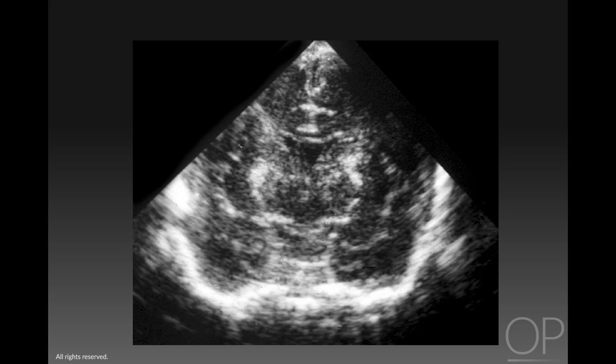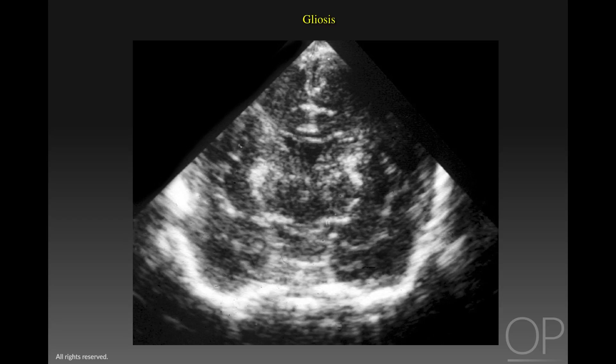Here is another infant who has brightly echogenic symmetric lesions in the basal ganglia. This child is now four weeks post-hypoxic ischemic injury, and these lesions gradually appeared over the last week. At autopsy, these areas represented focal gliosis. We do not generally see gliosis in premature infants; this is a phenomenon only seen in term or near-term infants.